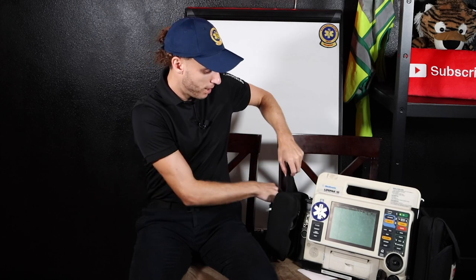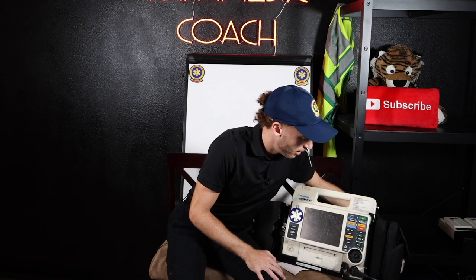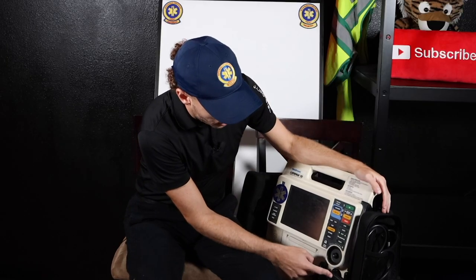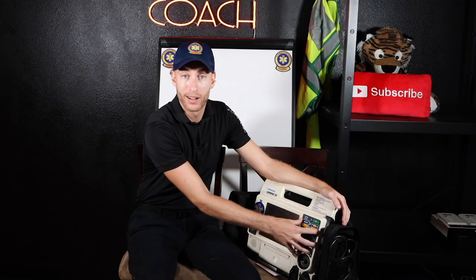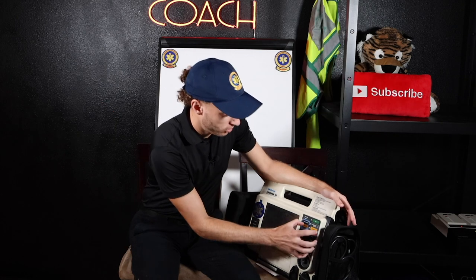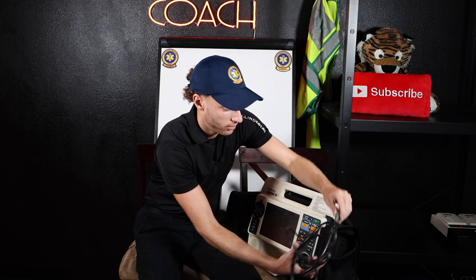The next thing I'm going to show you — I'm going to pop open these sections over here. Now, see this black piece right here? I'm going to turn the monitor over a little bit. This black piece right here is right underneath this section, which is the section for defib, pacemaking, cardioversion. Eventually we're going to shock the patient. That's the cord to the pads to do the shocking. The actual cord is right here — I'm going to show you all this. Here's our cord, you can see it.